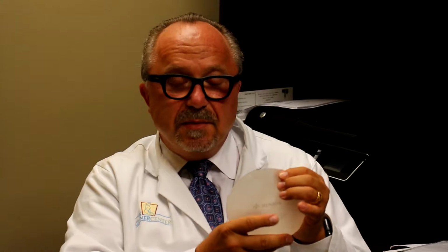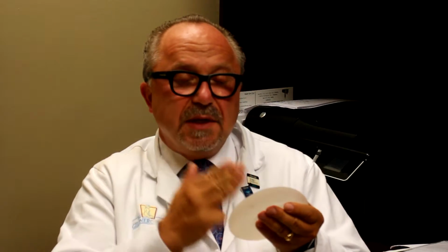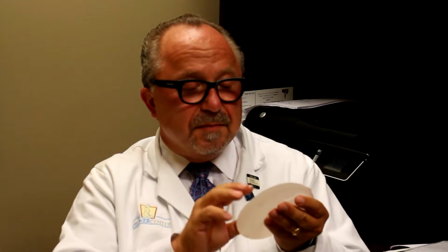In contrast, we take a look at the gummy bear implant. These are highly cohesive gel implants. The stuff that's inside of this, if I were to cut this with a pair of scissors, it would just be a big blob. It sticks to itself. It doesn't go anywhere. And that's why these implants were designed, so that we wouldn't have the possibility of gel migrating anywhere outside of the capsule or into the person.